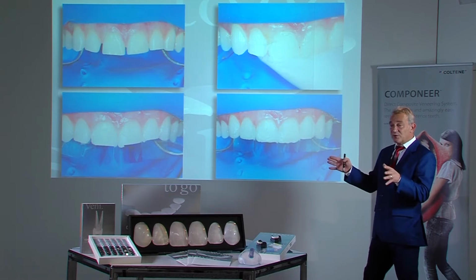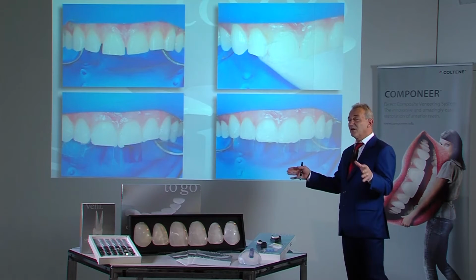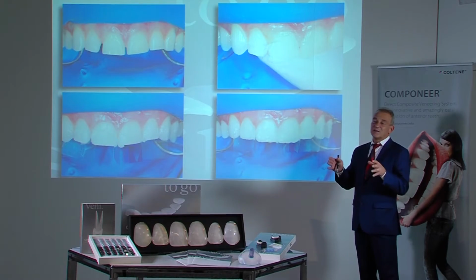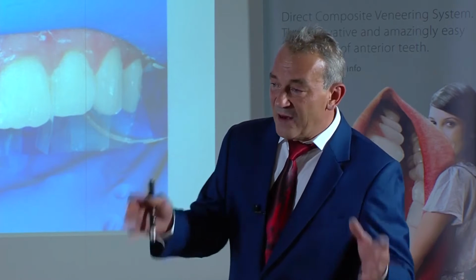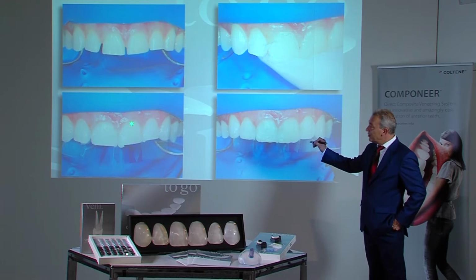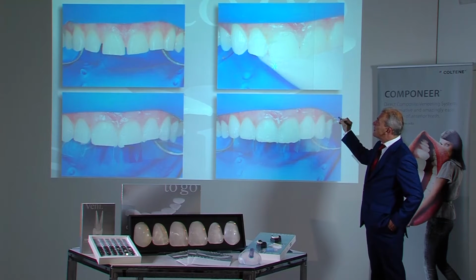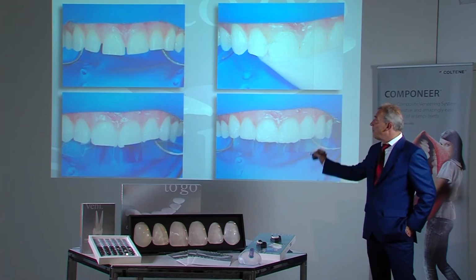It makes sense to close these gaps first, to mesial, and then to join up the teeth from lateral to mesial. This way, the tooth proportions can be retained. This is not a problem with a simple case like this, and the gaps can be closed readily for the time being. This was started from the gingiva, and note the depth of the papilla is still present.